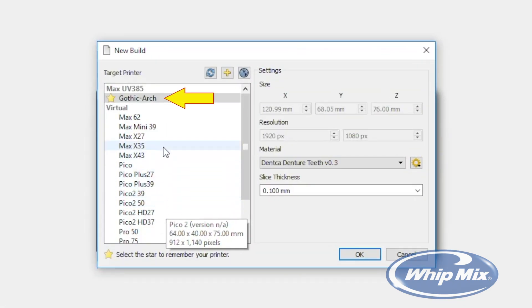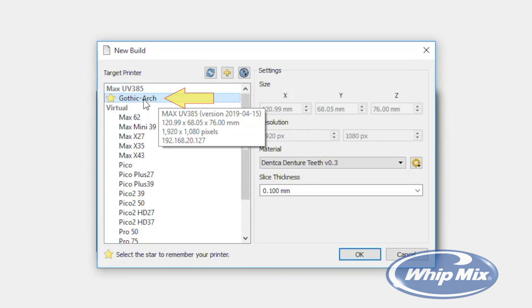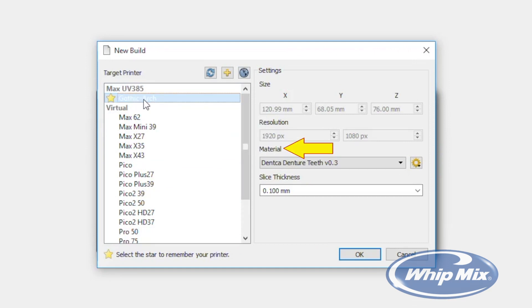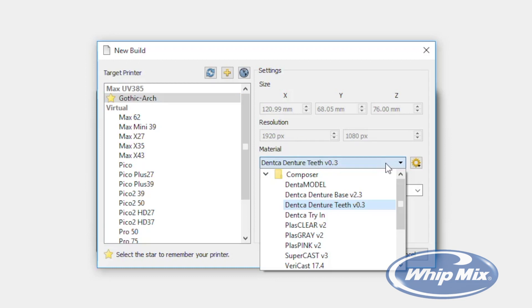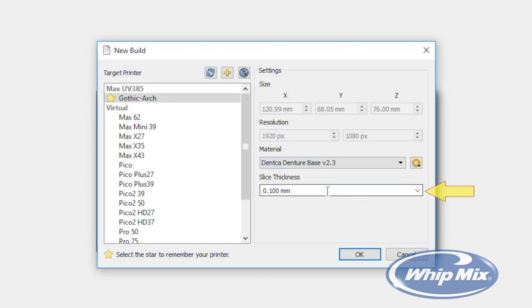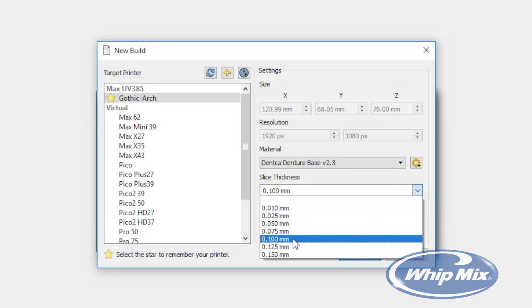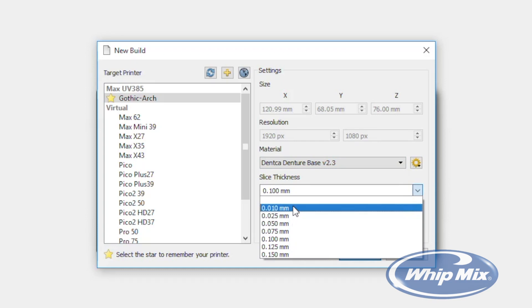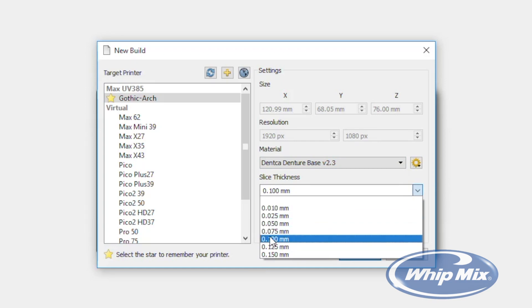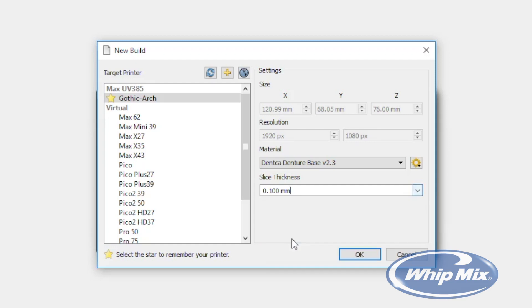Select the printer that will be used for this print. Now pick the material — for the bases print, select Denka Denture Base version 2.3. The next drop-down menu is the selection of slice thickness. The thinner the layers selected, the higher the quality, but it will take more time to print. Bases can be printed from 100 micron layers to 10 micron layers. For most base prints, 100 micron layers is the best option, allowing a great finish in a shorter amount of time.